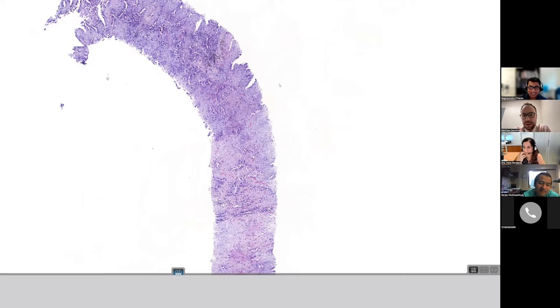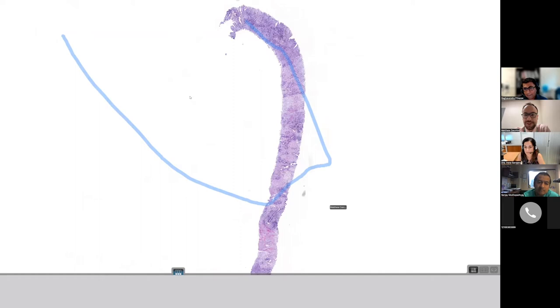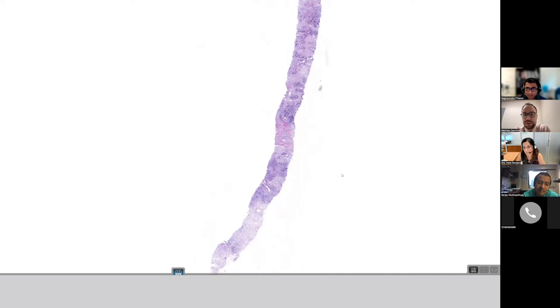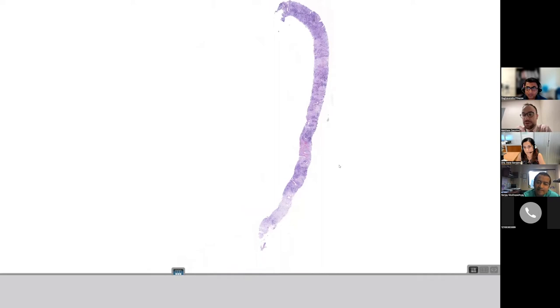Totally, and I agree with you guys. I think I would macro dissect this case. We circle and macro dissect most of our cases with our protocol. So I would probably take some. Oops, I drew it all over. But yeah, this part is the more tumor. As everyone said, the lymphocytes look smaller, but they have the same DNA content. So we tend to overestimate those, and in general we often overestimate the amount of tumor cells there. I would macro dissect this part, because the only part I want to remove is this one, but I imagine there are different approaches for that.